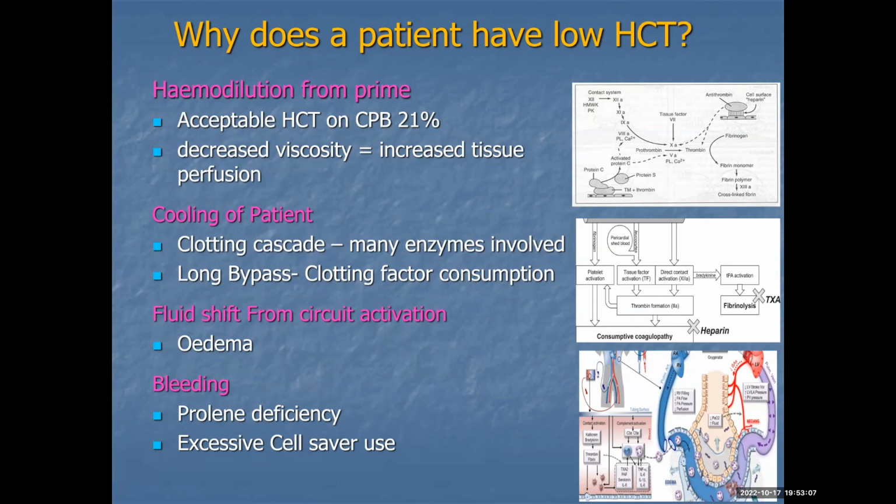They've had hemodilution. If we've got a 100 kilo patient that's had an extra litre and a half of volume from the heart-lung machine, it's probably not an issue. However, if you've got a little 60 kilo patient, somebody like myself, that's had a litre and a half, it's going to have a much worse effect, especially if your starting HB is 10 or 100, whatever denominator you want to use. When that patient goes on bypass, you're going to have a hematocrit of 21 or HB of 7. So one thing to think about is, if this patient's got a low HB, do we need to filter them? Do we need to encourage them to pee?